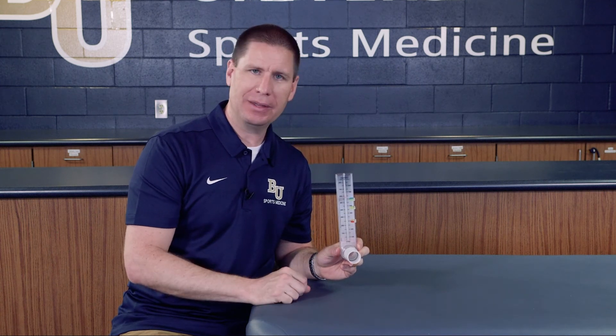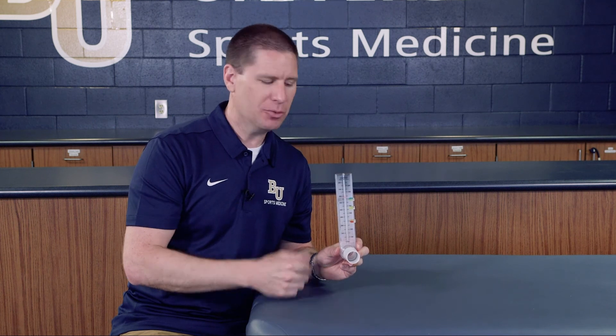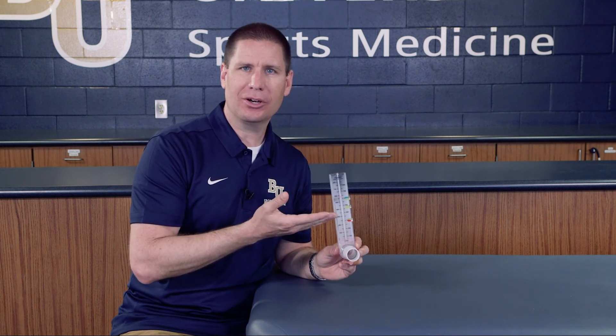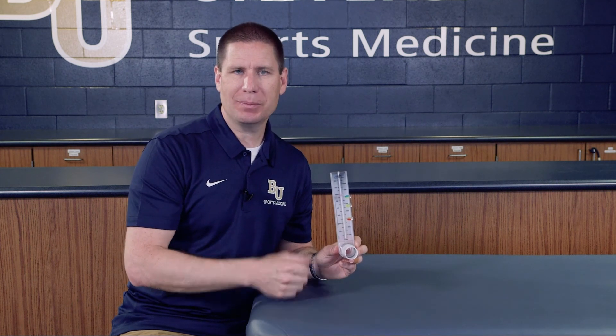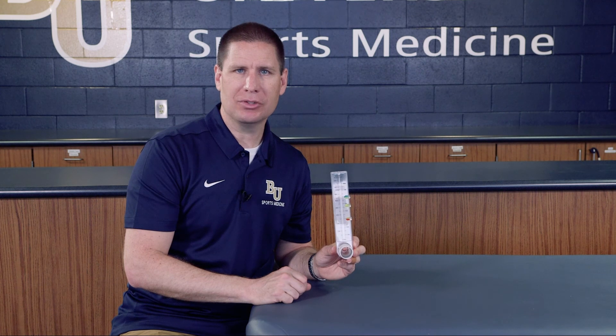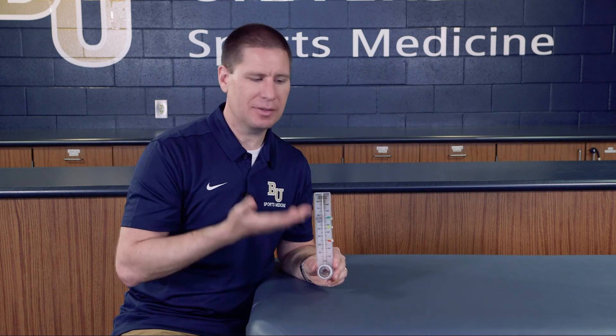You always want to take the highest reading, which is the maximum liters per minute — that sets our benchmark. So with readings around 620 to 630, take 80% and 50% of that to give you the upper and lower zone thresholds. You can set these for a particular athlete so that every day when they come in, they blow and see their measurements and manage their practice expectations based on how they're feeling that day.